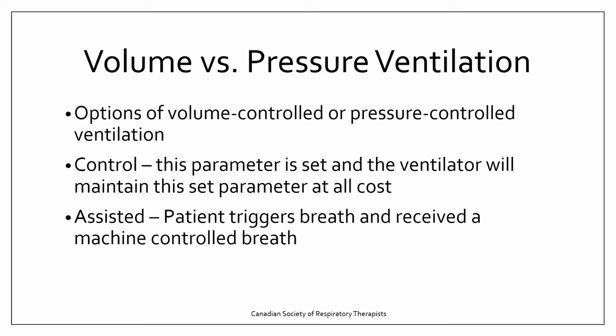But the basics of selecting a mode of ventilation: all modes kind of come down to, are they sort of pressure-oriented ventilation, or are they sort of volume-oriented ventilation? So when we look at the options for volume-controlled or pressure-controlled ventilation, our modes are sort of control and assisted, and really most modes are an assist control mode or a completely spontaneous mode of ventilation.